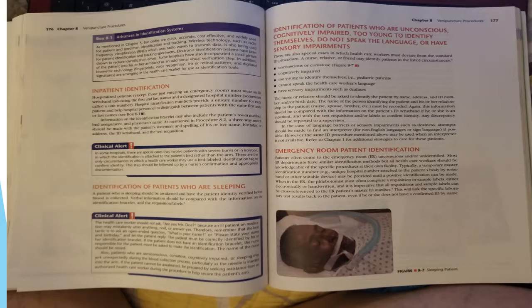The patient must be correctly identified by his or her identification bracelet. If the patient does not have an identification bracelet, the nurse responsible for the patient must be asked to make the identification. The name of the nurse should be noted. Also, patients who are semi-conscious, comatose, cognitively impaired, or sleeping may jerk unexpectedly during the blood collection process, particularly as the needle is inserted into the arm. If the patient cannot be awakened, be prepared by seeking assistance from an authorized healthcare worker during the procedure to help secure the patient's arm.